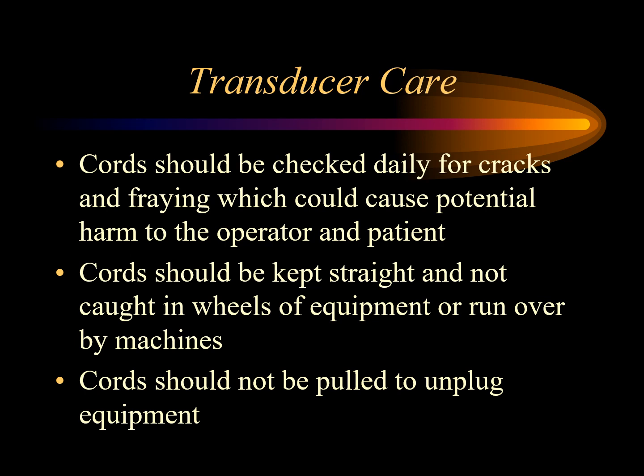And cords should never be pulled to unplug the equipment. Again, the equipment is very expensive and we want it to last for years to come. So always make sure that you're taking good care of the ultrasound machine itself and especially the transducers.